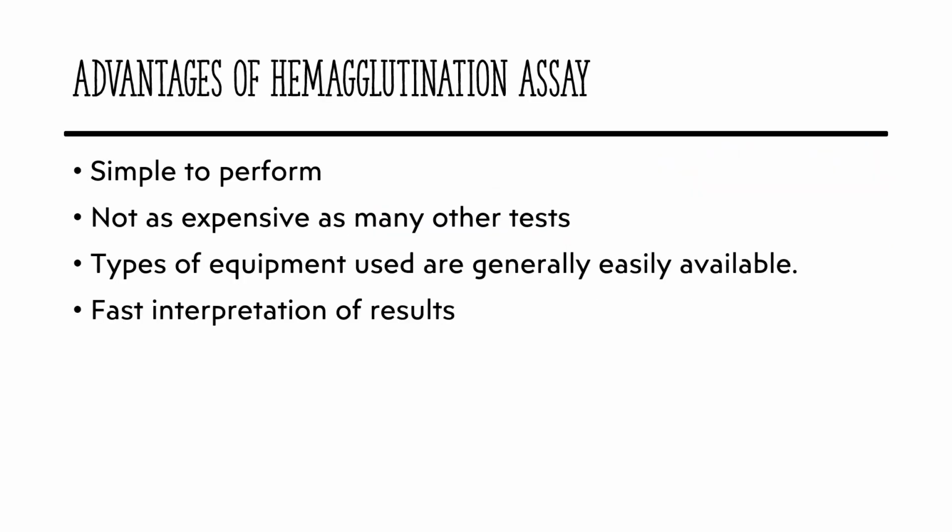Advantages of hemagglutination assay. It is simple to perform and not as expensive as many other tests. The types of equipment used are generally easily available, and one can get fast interpretation of results.